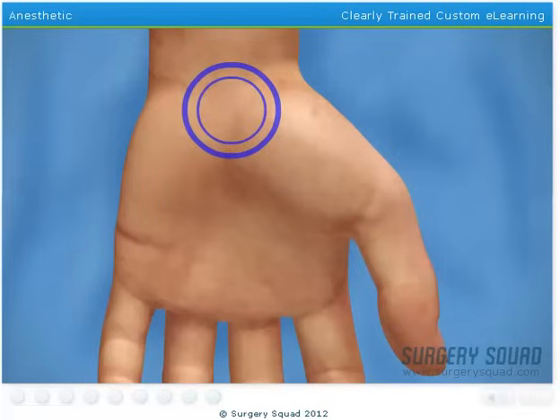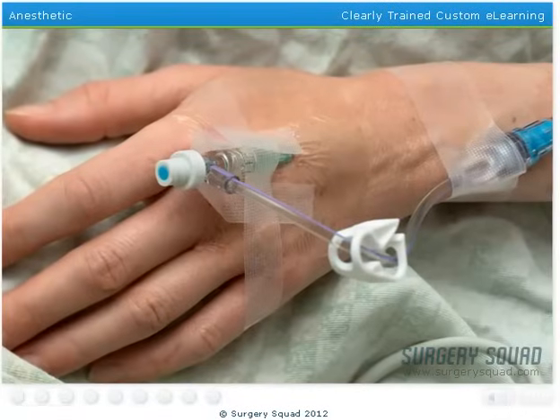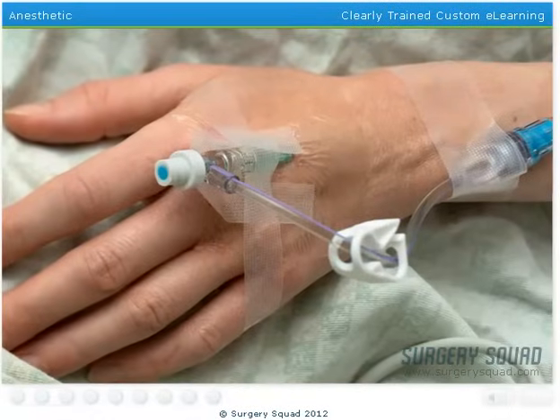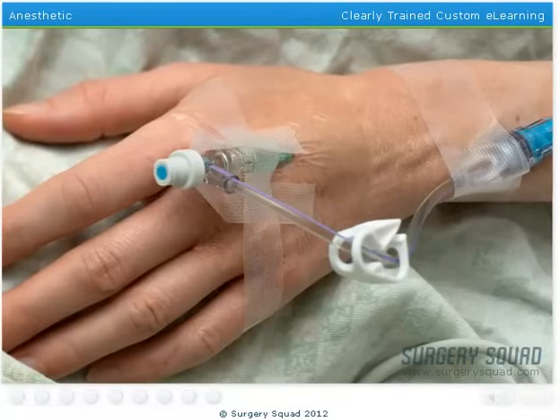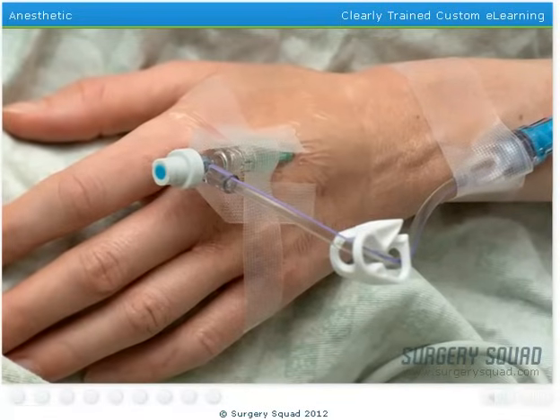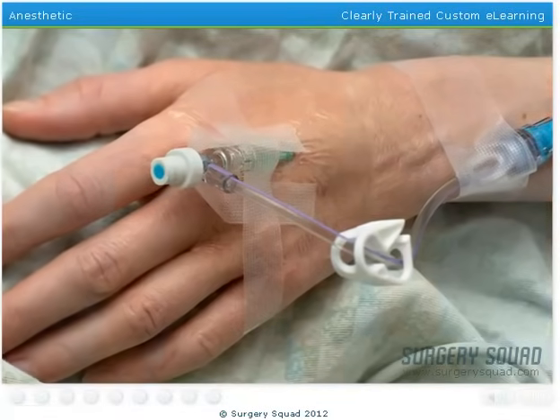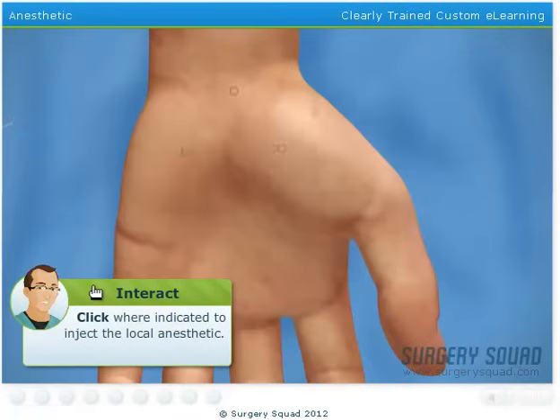If a patient is nervous or uncomfortable, I'll sometimes use a sedative as well. A sedative is a drug given through an IV that places the patient in a dreamlike state. However, our patient today will only receive the local anesthetic. Go ahead and get the operating area numb.